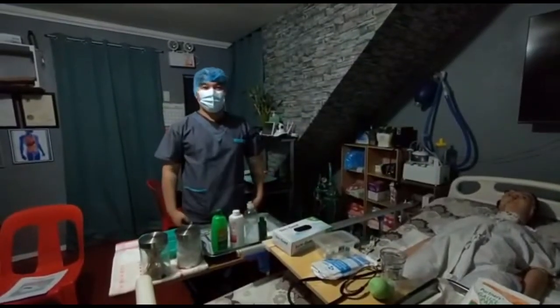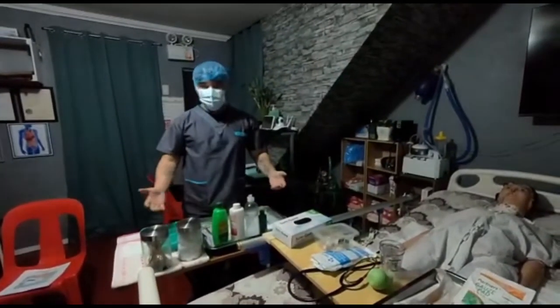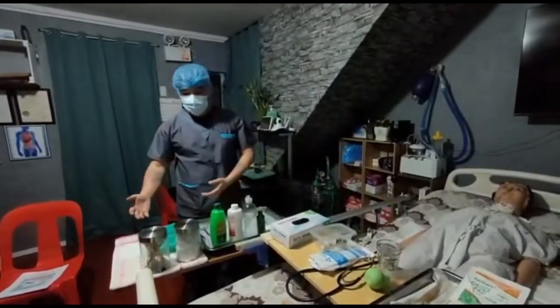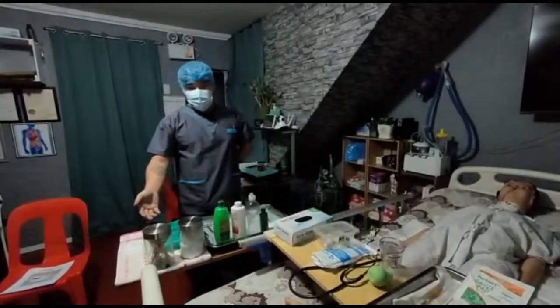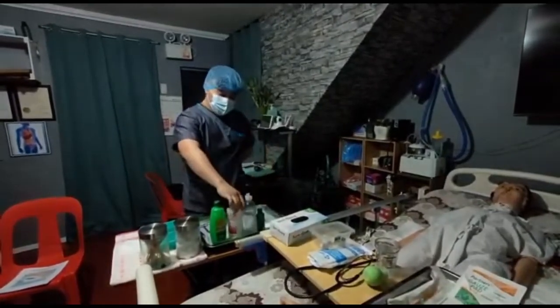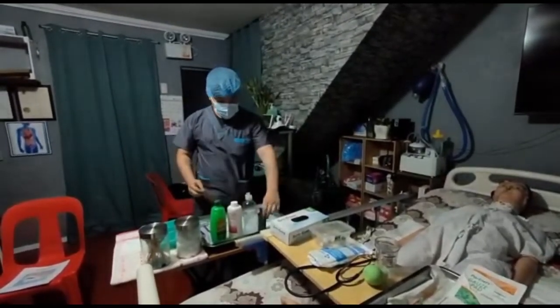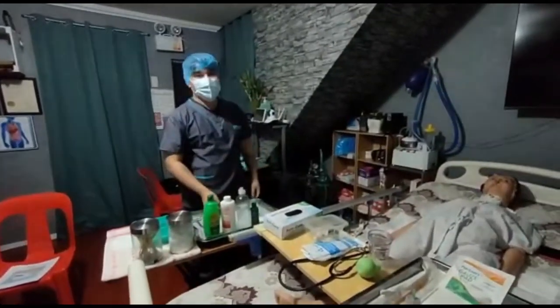Gagawa tayo ng tracheostomy care sa ating client with a tracheostomy. So I have already prepared my equipments here. Meron tayong mga kidney basins, cotton balls, cotton tip applicators. We have this NSS, hydrogen peroxide, alcohol, povidone, gauze pads, and mga clamps. And of course, meron tayong clean gloves.